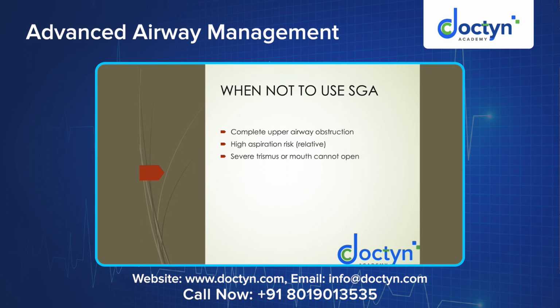And when not to use a supraglottic airway. This is also very much important. As we have discussed, where does the supraglottic airway go? Through the mouth. So if there is severe trismus, for example temporomandibular joint issues, or you're not able to open the mouth for any reason, or there is not enough space to insert the supraglottic airway device in the oral cavity, you would prefer to avoid supraglottic airway insertion.